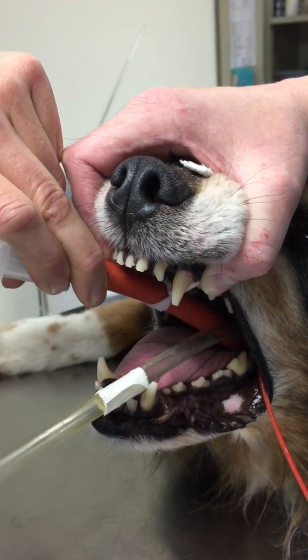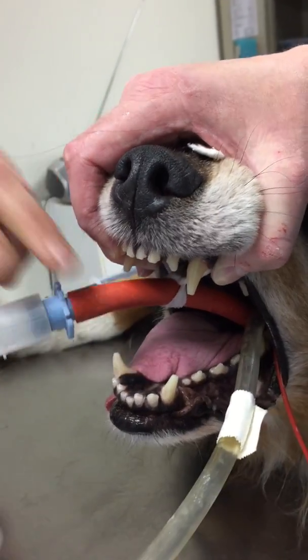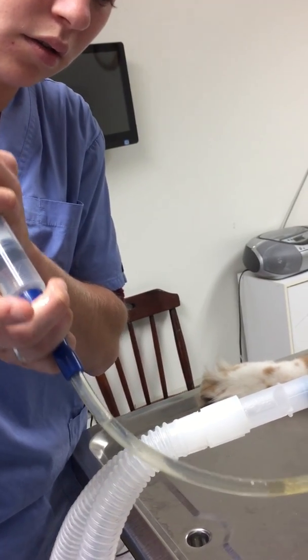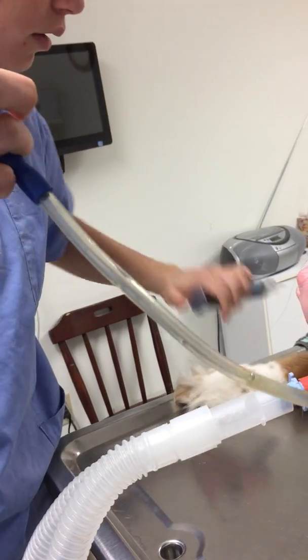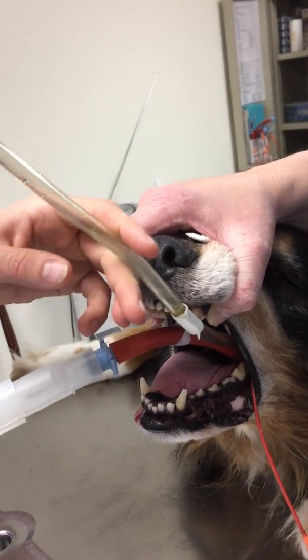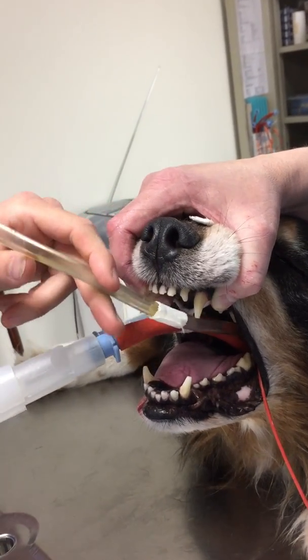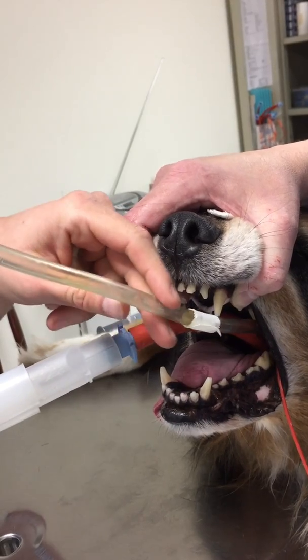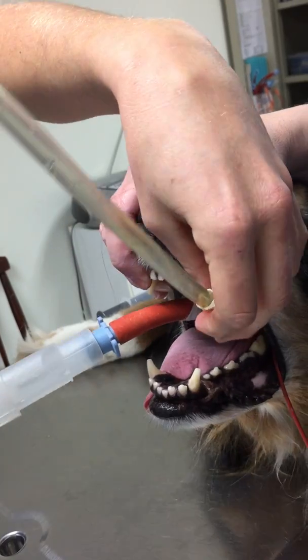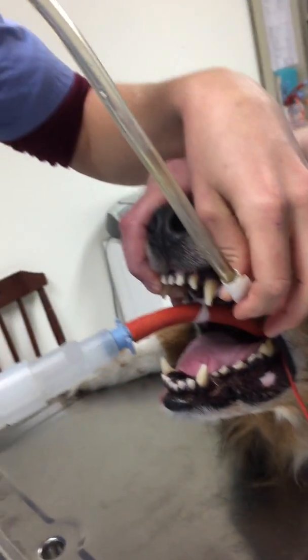And then to make sure that we have it in his stomach, I'm gonna put some solution in here. Beautiful. I don't hear anything but the water is still here in the tube — it'll go down so far.